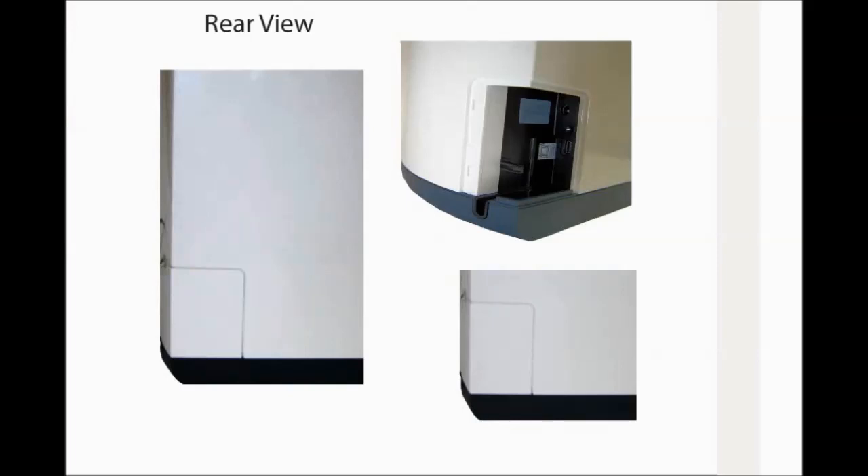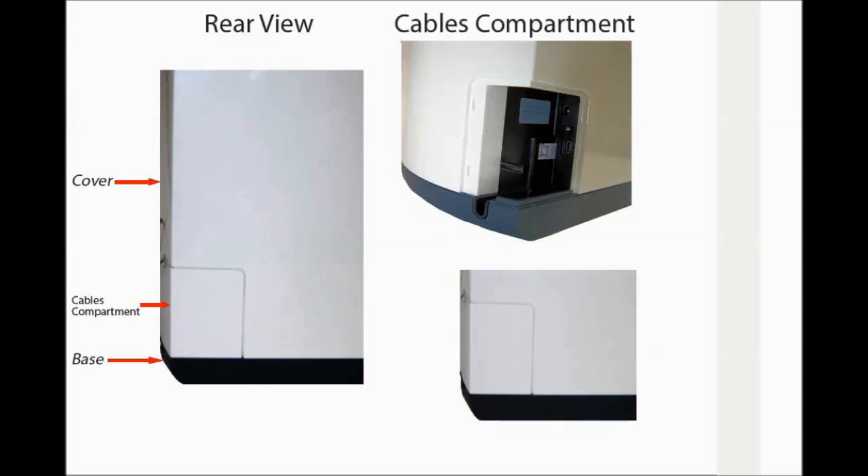CS7200 rear view: base, cables compartment cover. CS7200 cables compartment: power supply inlet, USB port, cable compartment cover.